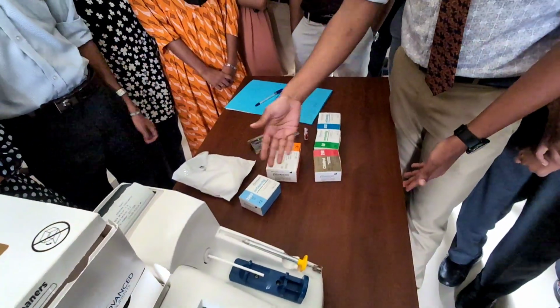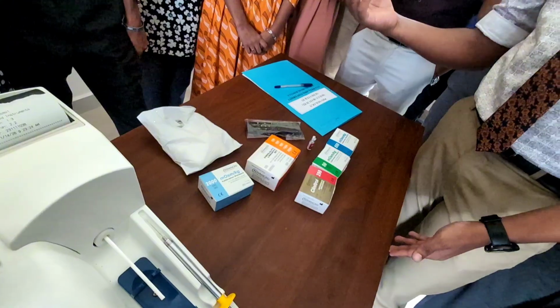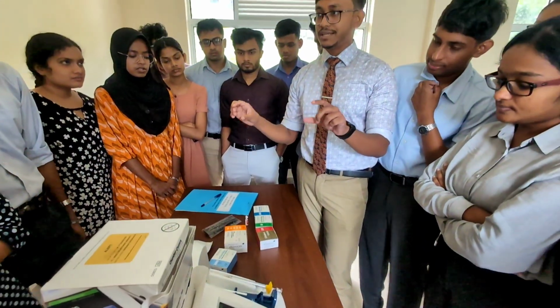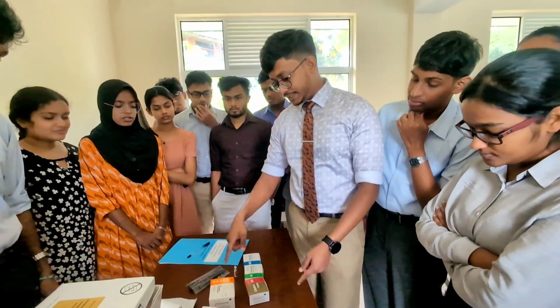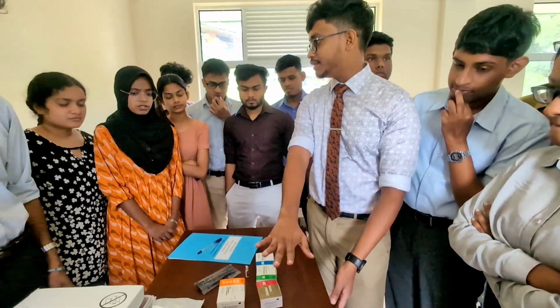And these are the calibration solutions. You know how before we use any machine, we have to check whether the measurements are correct or not. So to do that, we use these solutions. These solutions are calibrated so that these exact values are usually read out by the machine, right?